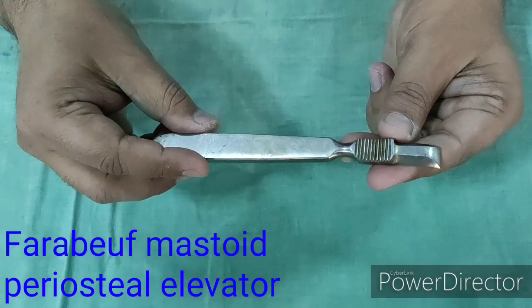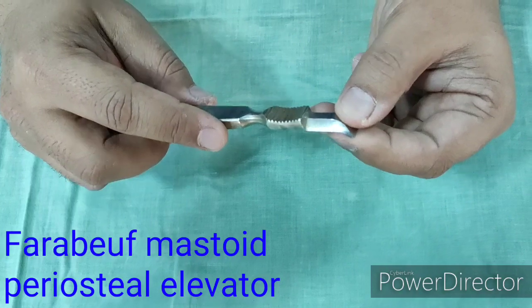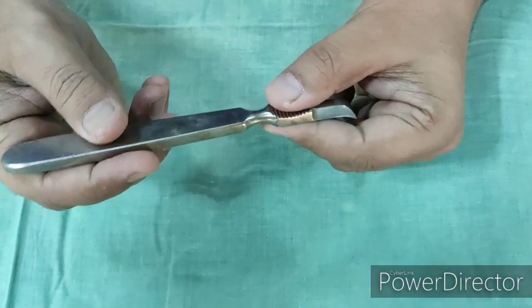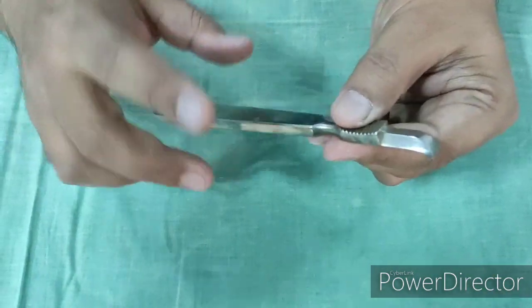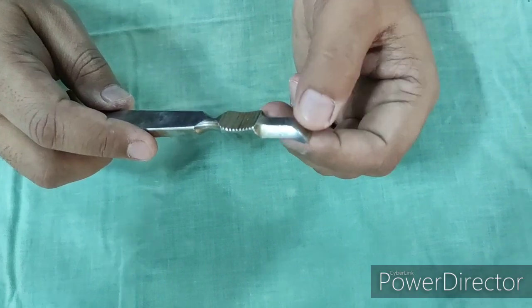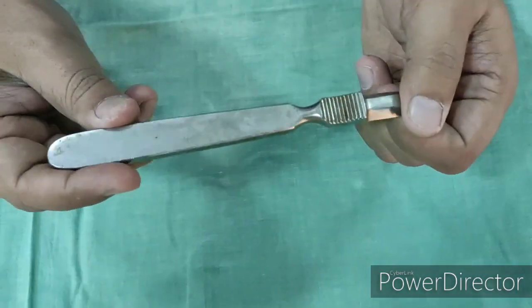This is Farabeuf's Mastoid Periosteum Elevator. This is a stout instrument used in ear surgeries — for example tympanoplasty and mastoid surgery — to elevate the periosteum and make the bone bare before drilling. It is also used in other surgeries to elevate soft tissue, for example in maxillectomies, caldwell-luc surgery, or mandibulectomy.